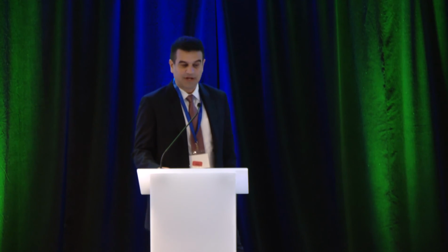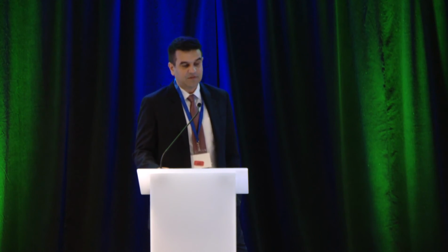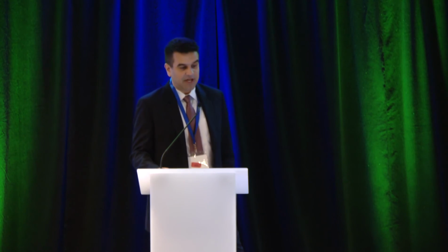Now, the authors of 4.0 also talked about inconclusive manometric diagnoses of EGJOO, although I also told you that overall, it's always clinically inconclusive if you just have a manometric diagnosis without some of the other things like symptoms and esophagram or FLIP. But you might have this inconclusive diagnosis with an isolated elevated median IRP supine, upright, or having just supine intrabolus pressure. And you're going to hear in the next few talks about some of the additional considerations and how to really apply them in this diagnosis or potential diagnosis, with the rapid drink challenge, solid food, and even pharmacologic provocation to support your manometric diagnosis of EGJ outflow obstruction.